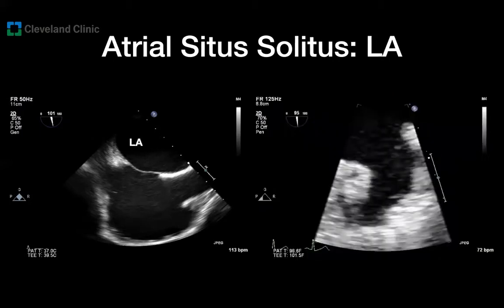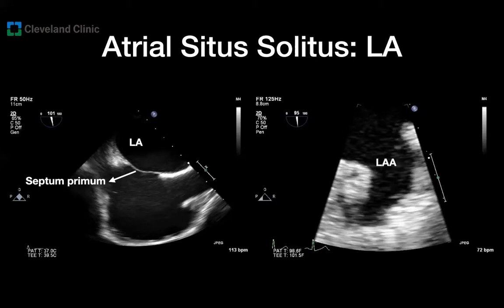Now let's move to the left atrium. The image on the left shows the atrial septum from the bicaval view. The septum primum embryologically belongs to the left atrium and is a left-sided structure. The image on the right shows that the normal morphology of the left atrial appendage should be elongated and finger-like with a very narrow base — very different from the right atrial appendage.